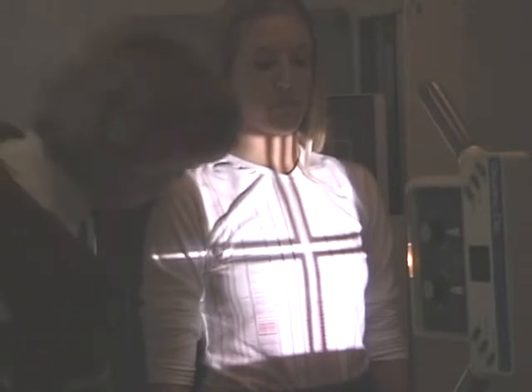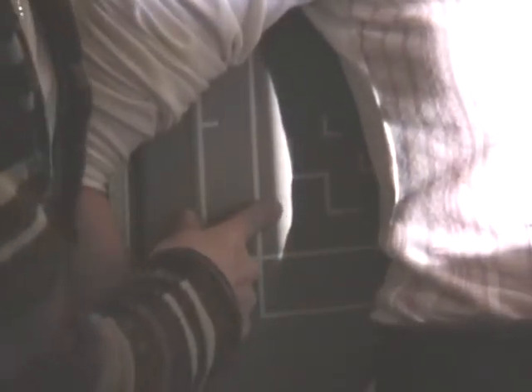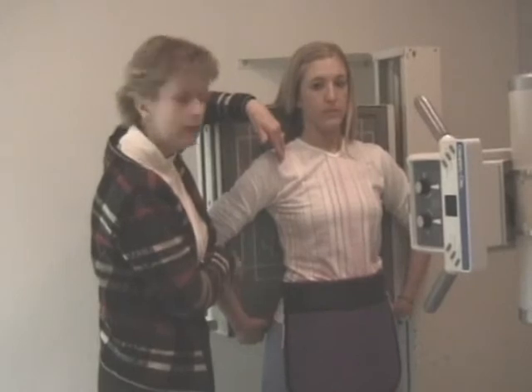Now we're going to just have her elevate her arm here for a second, and can you see the light here on the board? Again, her mid-sagittal plane's to the center of the film, and I have light on that board, and that means I have light on that side, so I am not clipping any portion of her rib cage. So I'm very happy with the centering of this.